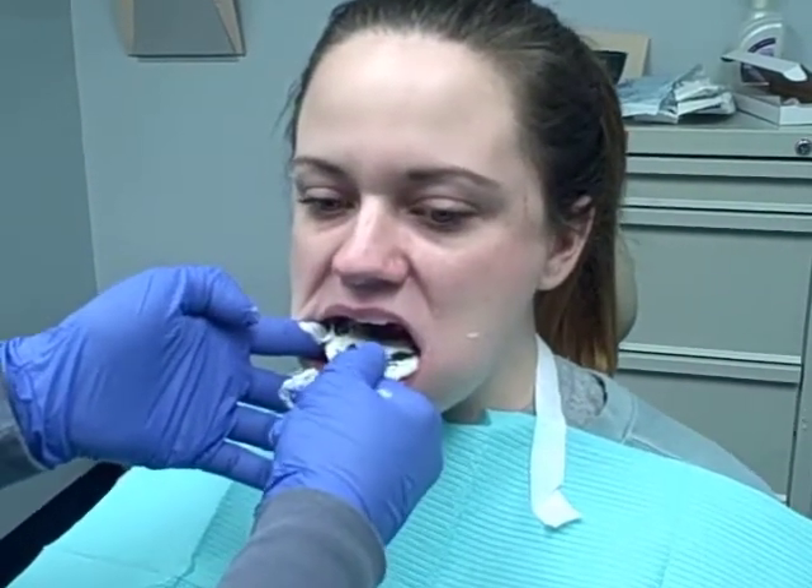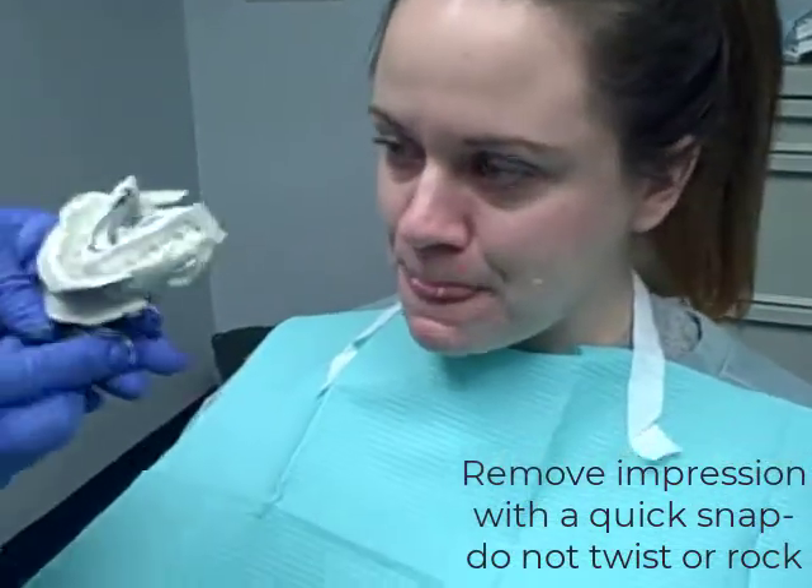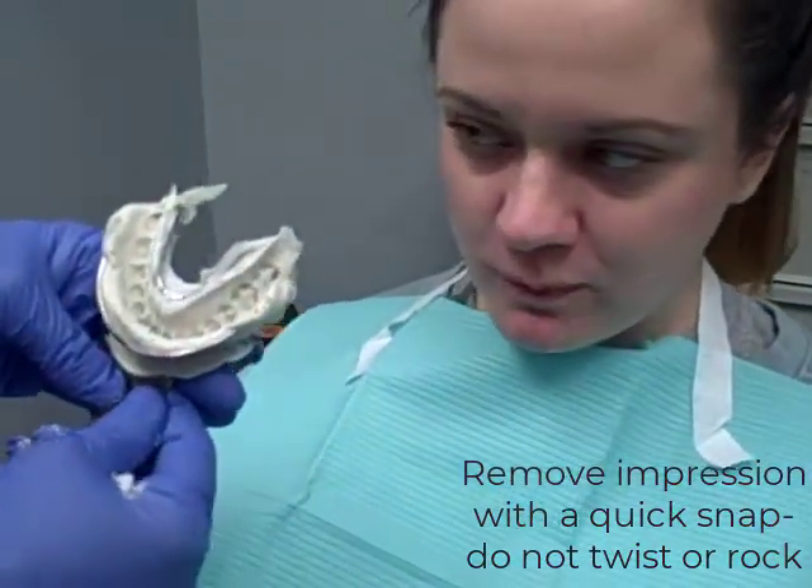You want to hold it here, and kind of slide it out. And there's the mandibular impression.